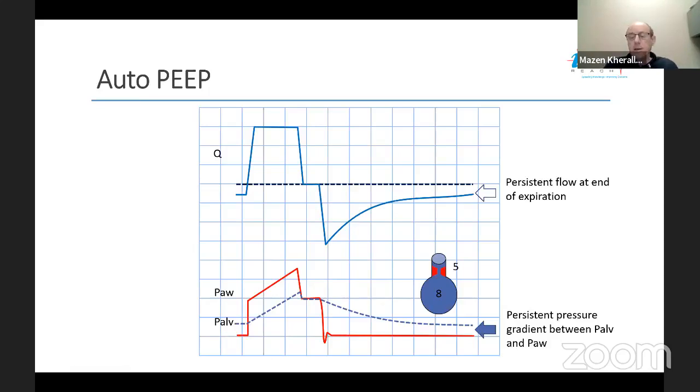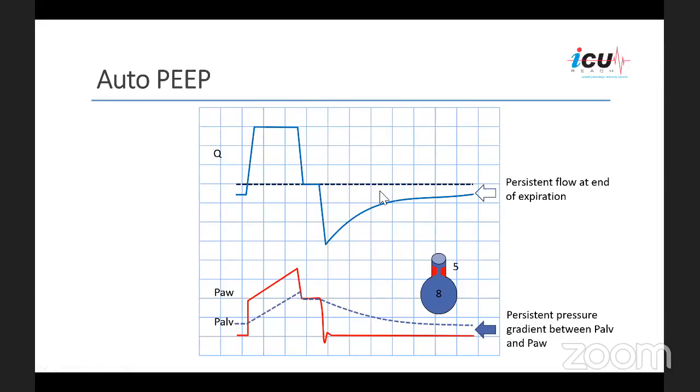Okay. Thank you. I think we are 10 minutes past my time. Any other questions I can answer quickly? Yeah, so is there a preferred mode of ventilation other than VC versus PC?